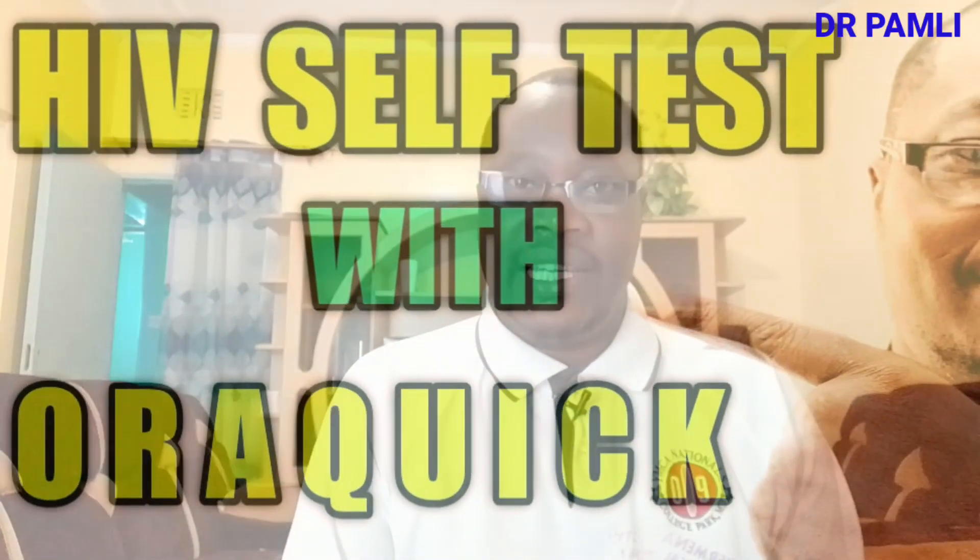Welcome back, and in today's video I'm going to teach you how to do an HIV self-test. We are going to use the OraQuick HIV self-test kit.